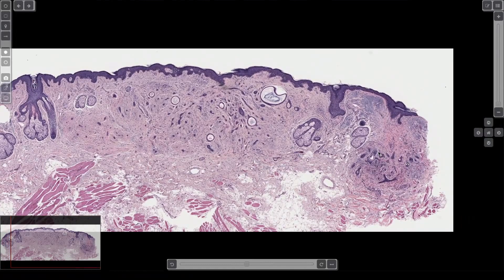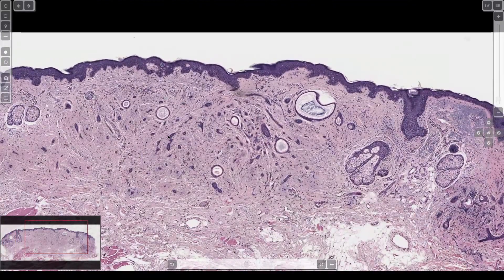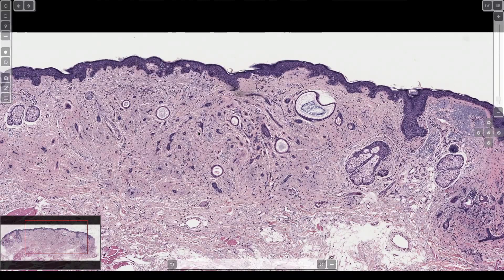After that walk down memory lane, here we have something abnormal. How would you describe these? Little cords or strands of epithelial cells in the dermis in a tadpole shape — or sperm shape if you prefer that analogy. You have to find the visual analogy that works for you. My way to remember it is 'sperm in the derm.' If you're more old school, you could say paisley tie pattern. Either way, these are little cords in the dermis.